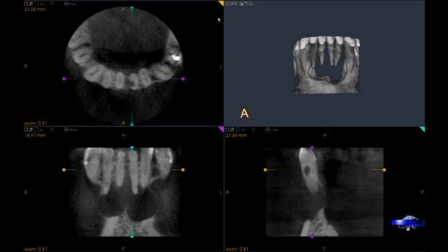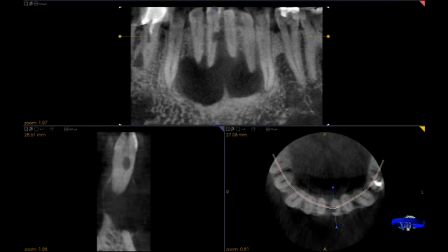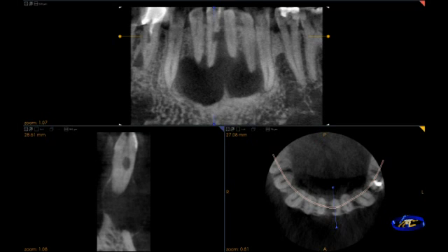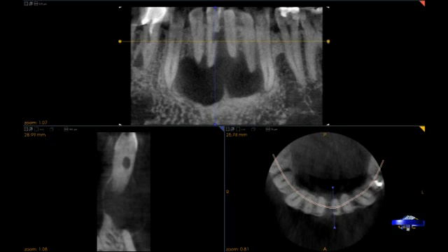We can clearly see on both the sagittal and axial views a resorptive defect on the tooth that has encroached upon the root canal system — likely the etiology for this radicular cyst. In the panoramic projection we can clearly see on the cross-sectional views and the axial view this defect and how it involves the root canal system. We can move the cross-sectional cut back and forward to better understand how this lesion affects the tooth.